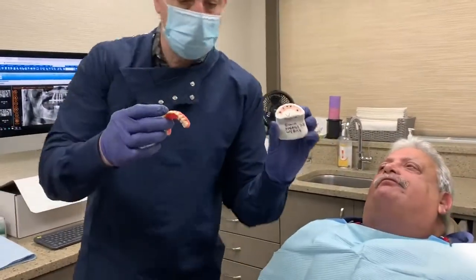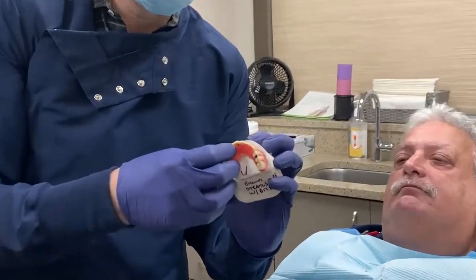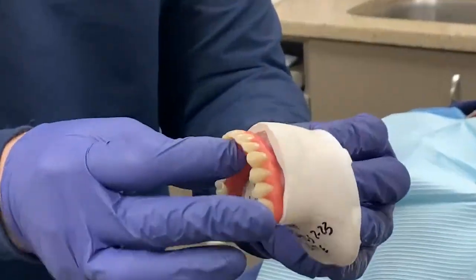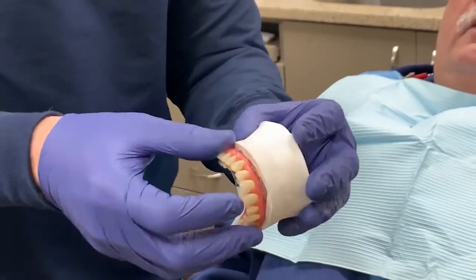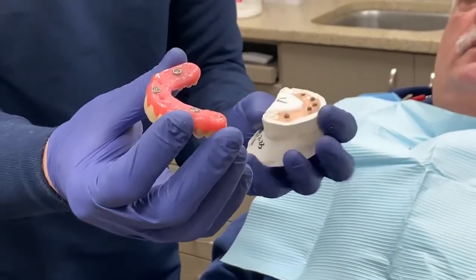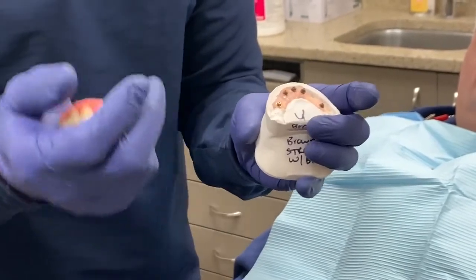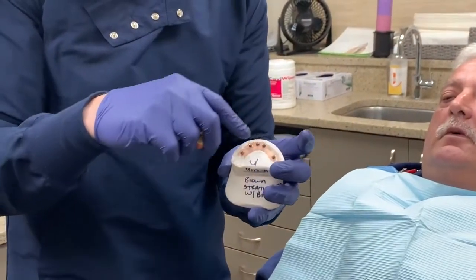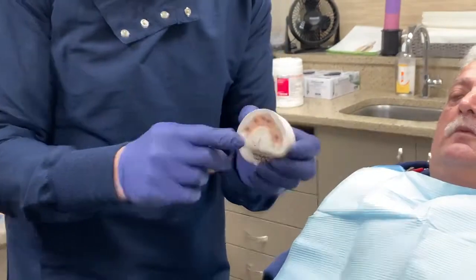And again, this is the cast that this mock-up was fabricated on. And so this mock-up goes right to the tissue. And again, there's no ridge lap. And that's exactly what I'm talking about, what we want to see and what these immediate load cases provide us with. We allowed the provisional prosthesis to develop the soft tissue. And that's all accounted for in the pre-plan. So we're going to try this in.